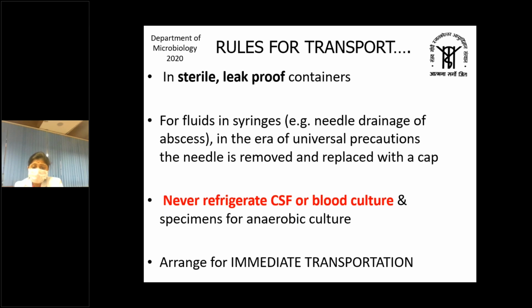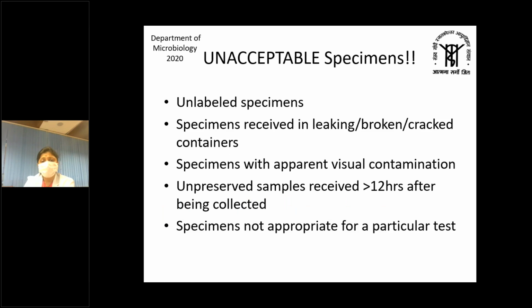If you have an incubator, then it is best to put the sample in the incubator. We have a 24/7 stat lab facility, a 24-hour lab over here. So there is no issue, but if at any time in the ward you are not able to send the sample to the laboratory, then you should never refrigerate CSF or blood culture. The reason is that there are a few organisms which are very fragile, and at cold temperatures they will die out and we will not be able to retrieve them on culture. So always arrange for immediate transportation.